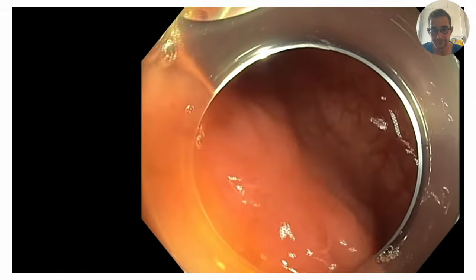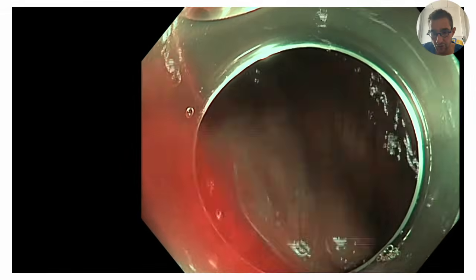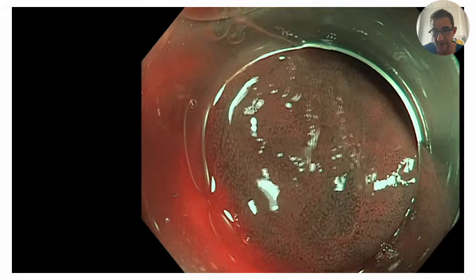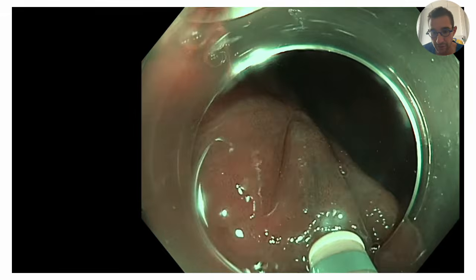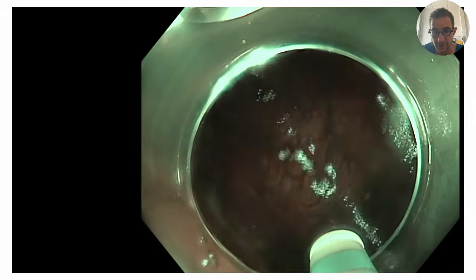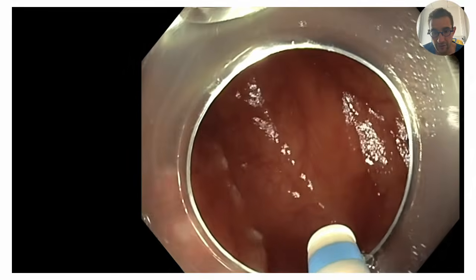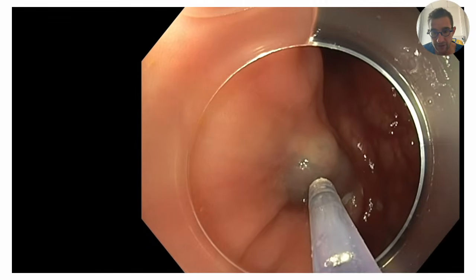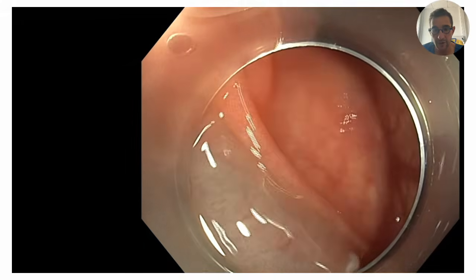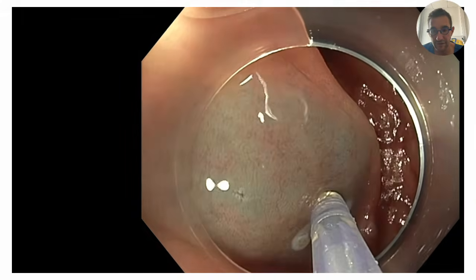So the case here is a double recurrence with two small adenomas surrounding a scar area. We decided to remove all the area, going relatively far from the scarring process in order to have an area which is able to be injected and that has a good lift up to create a cushion and find the good layer outside the fibrosis.